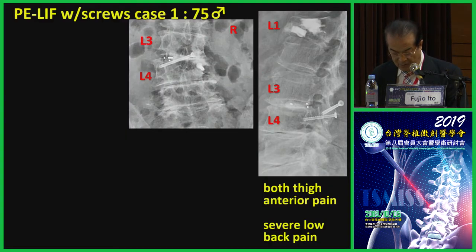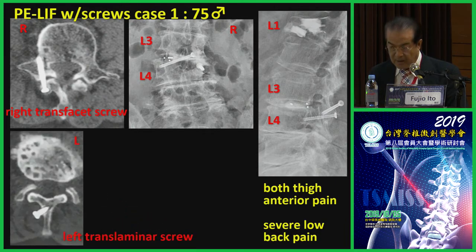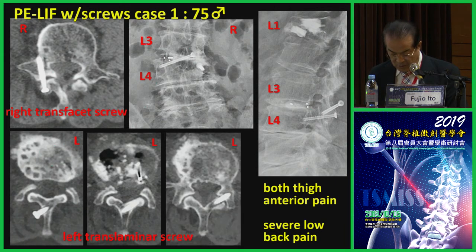This 75-year-old male has continuous bilateral anterior thigh pain and severe low back pain. He had also had L1 vertebroplasty before due to severe osteoporosis. PE-LIF was performed at L3-4 with hybrid facet screw fusion. CT shows the right transfacet screw. The left translaminar screw was inserted from the right side through the lamina to the left.